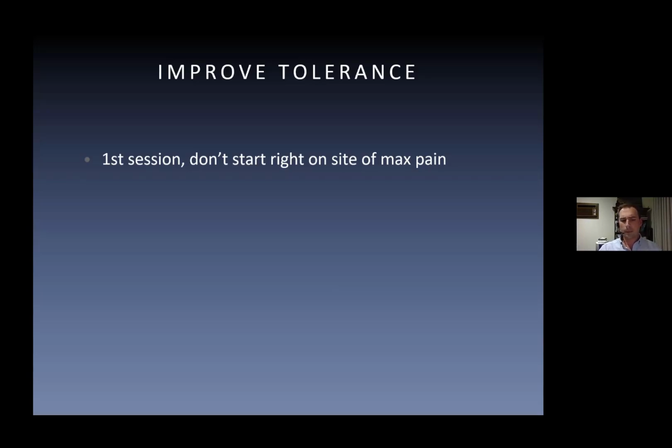Also, when I move the shockwave machine to a new area, you'll have a bit of an increase in pain, but after about 15 or 20 seconds, that will dissipate and the pain will drop considerably. Explaining those expectations to patients can be really helpful. If the patient's having trouble tolerating it, use a higher frequency. It's generally less painful for them.